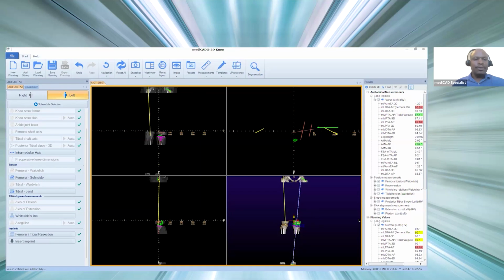So definitely, to summarize, it's definitely more accurate. It has AI. It is AI-assisted surgical planning, a faster procedure with reduced intraoperative adjustment, improved patient outcome through better alignment and implant positioning, seamless PACS integration, and regulatory compliance. The plan is also regulatory compliance. If you get audited, you have the plan to show that you followed the proper steps and so forth.